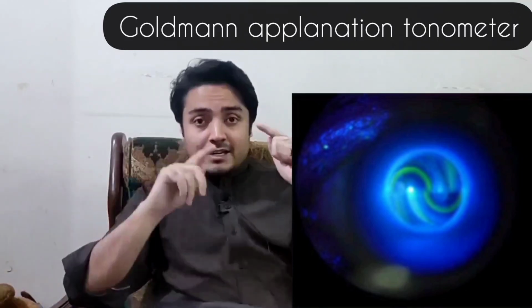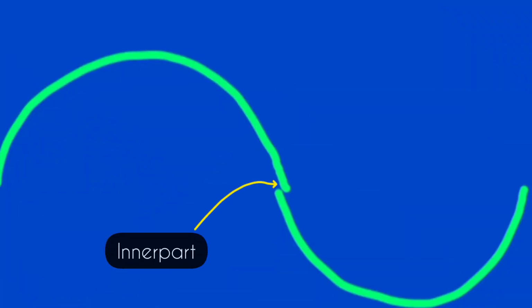The inner part of these two semicircles should be just touching each other. That will be the ideal reading on the dial. If the mires are away from each other, that means the pressure is high, and you need to increase the dial reading. If the inner parts of the semicircles overlap, they have gone inwards, that means you have exerted more pressure, and you need to lower the dial reading. And if they are just touching each other, as you can see, then this is the ideal reading.